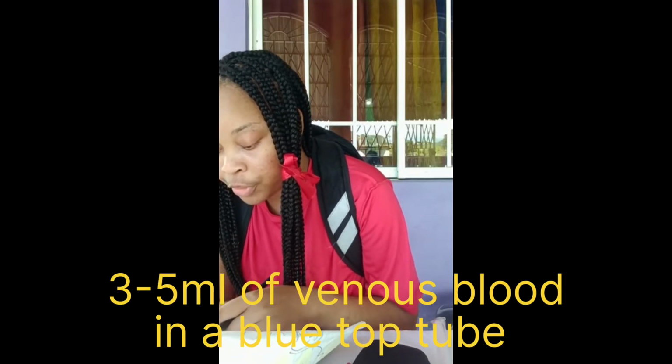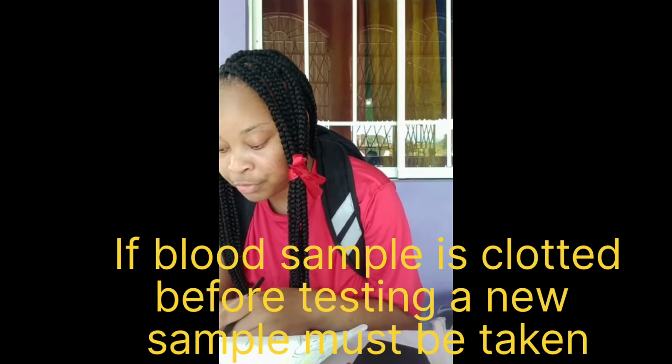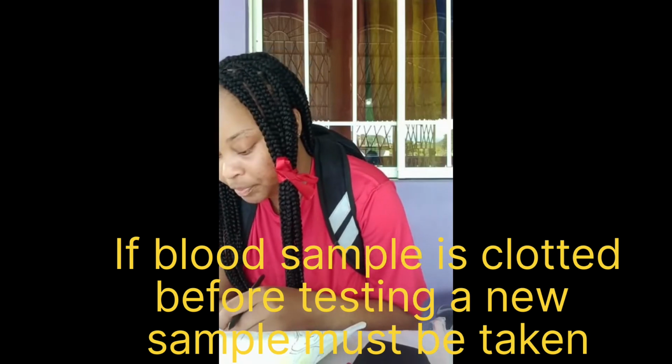Handling of sampling: collect 3 to 5 ml of venous blood in a blue top tube containing 3.2 sodium citrate until it is filled to its capacity. Test the blood within 2 hours to prevent the inactivation of some factors. Transfer the blood sample drawn immediately to the laboratory with ice packs. Note briefly, if the blood sample is clotted before testing, a new sample must be taken. List on the laboratory slip the drugs the patient is taking that may affect the test result.